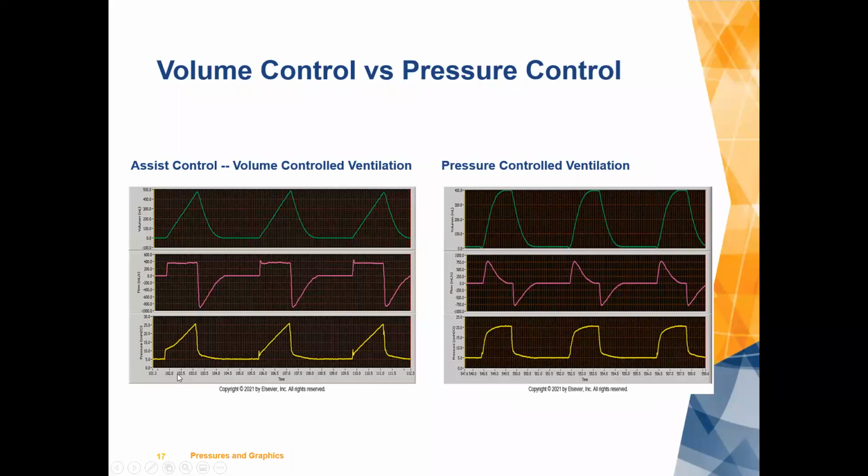Okay. And just to quickly point out a couple of things here. What you have on the bottom right is, in pressure, a pretty level amount of pressure there. It's not ramping up. It's not an accelerating pressure like you'd have with volume ventilation. It reaches its peak, it levels off, and then it goes to a release, because with pressure control ventilation, it's usually a time cycle that's involved. So just by looking at these, not only is this what they look like normally, but they can also help you distinguish what mode that patient is actually in.